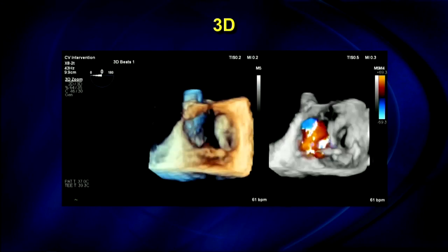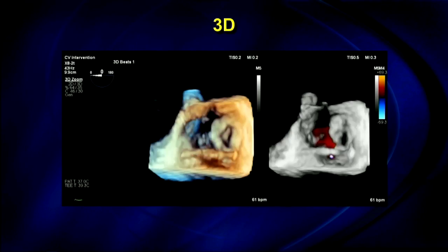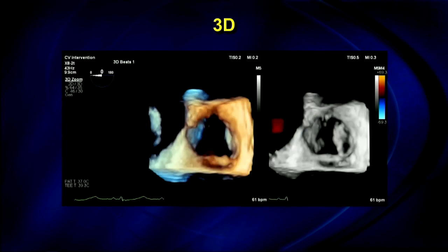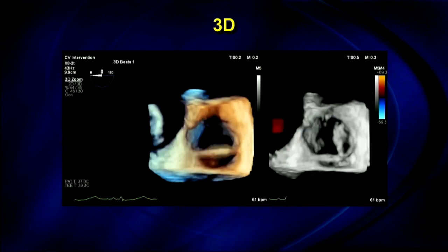Here's another example where we have a coronary sinus lead, and the 3D is helpful because it tells us that the regurgitation is mostly anterior to that coronary sinus lead, so we probably have a good shot of getting at the tricuspid regurgitation without being affected by the lead.